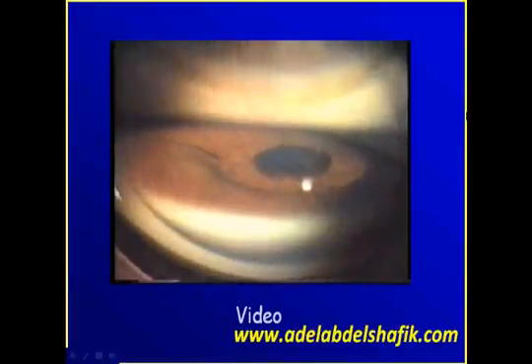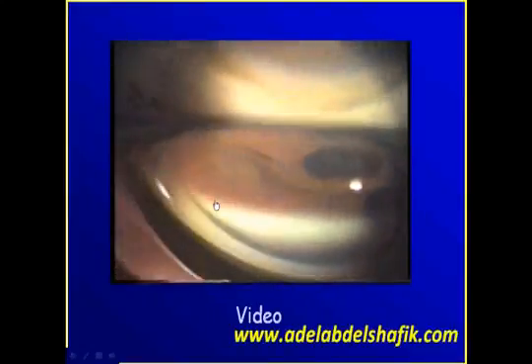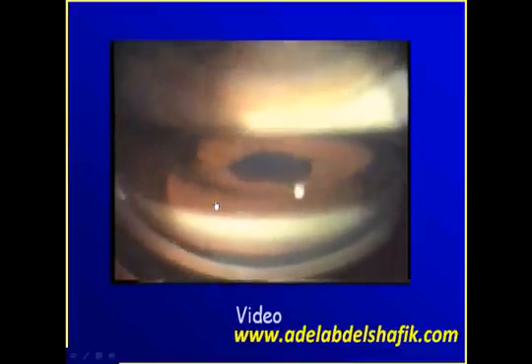We can watch this video, and you notice that the central area of the iris is pushed more forward compared to the peripheral part. This is the concave appearance of the iris in cases of pigment dispersion syndrome.